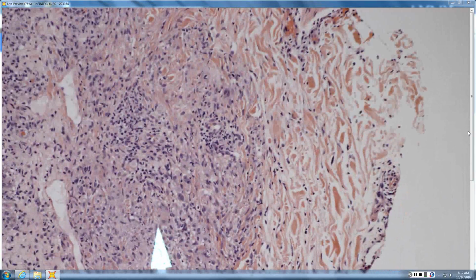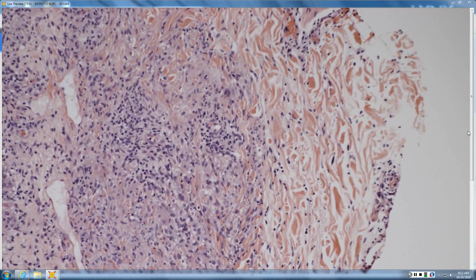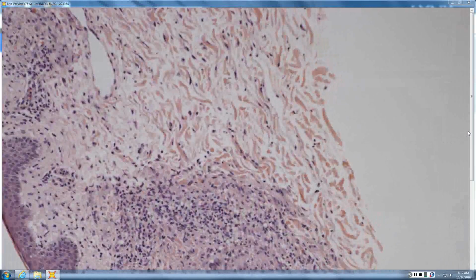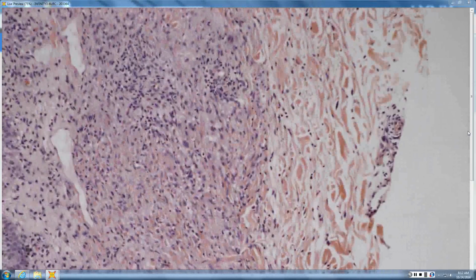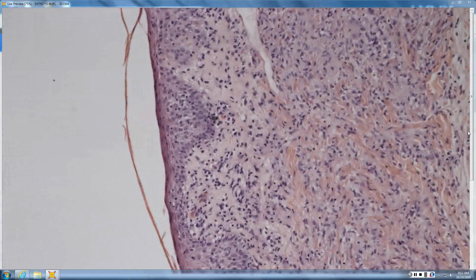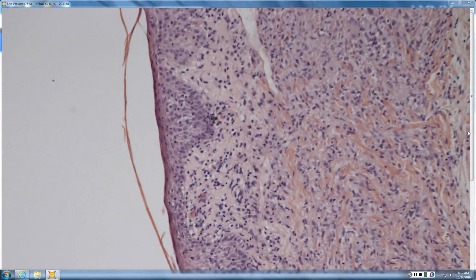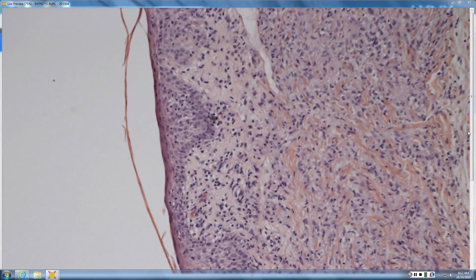So there's some giant cells. Yeah, so there's some granuloma. I think this is just JXG, but is your epidermis normal? No, so LCH maybe. So LCH, if you have histiocytic with epidermotropism of histiocytes, these look more like lymphs, just black circles, and you have some interface dermatitis. So I see interface dermatitis with lymphs.